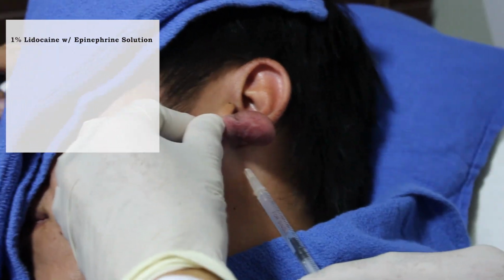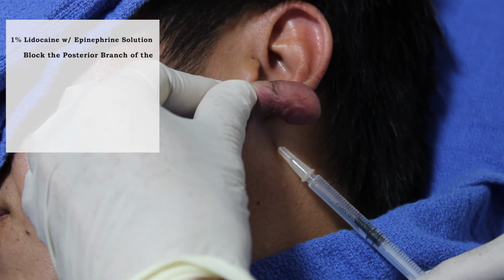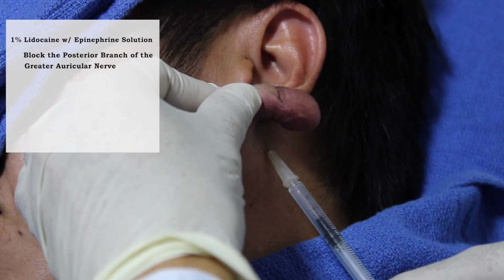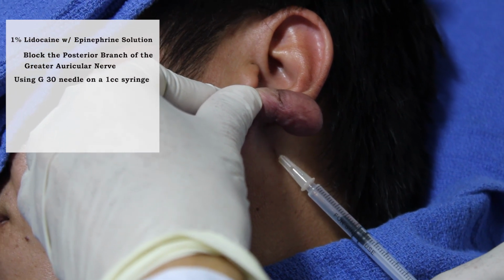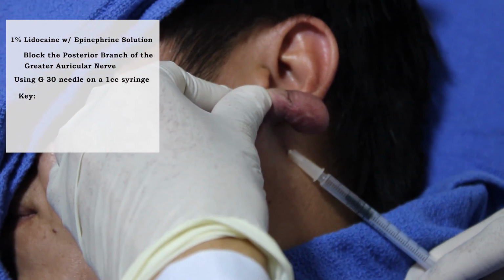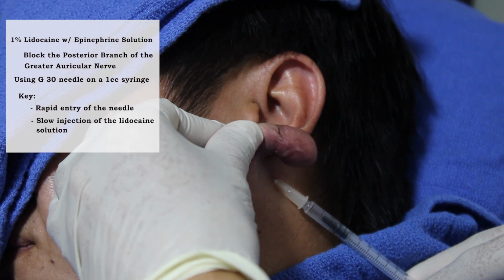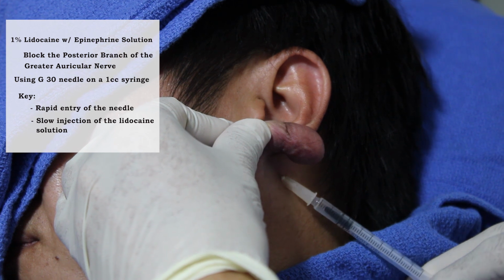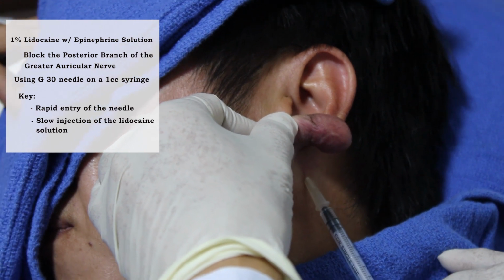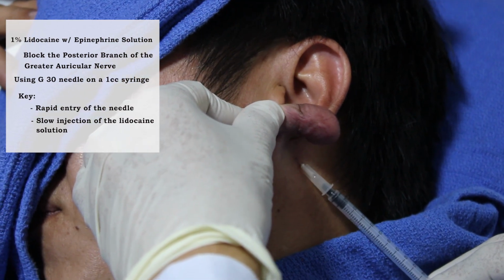This is 1% lidocaine with epinephrine solution. We block the posterior branch of the greater auricular nerve. So this is where to block the nerve. I'm using a gauge 30 needle on a 1 cc syringe, and the key is rapid entry of the needle, okay, and then slow injection of the lidocaine solution, so that the patient barely feels any pain. It innervates or gives sensation to the lower half of the ear.